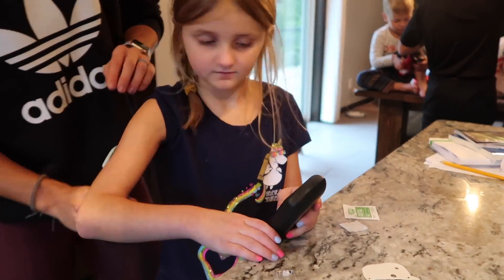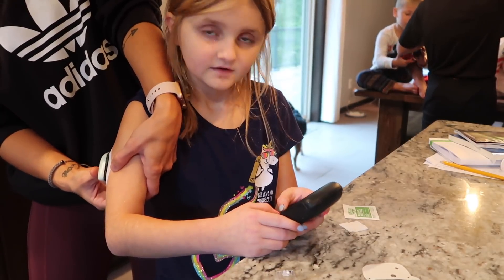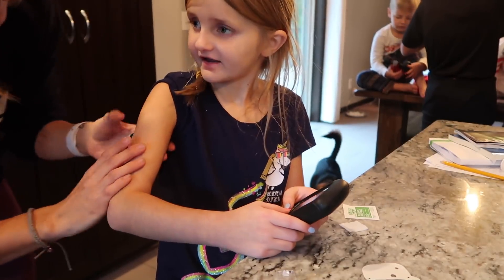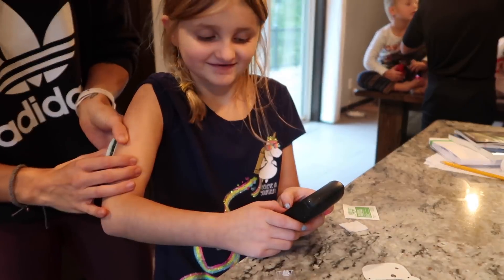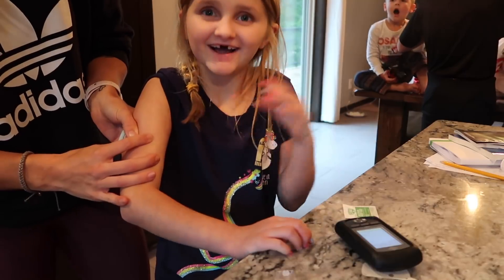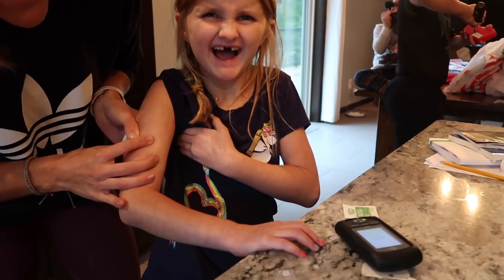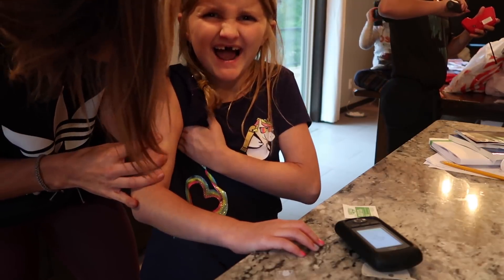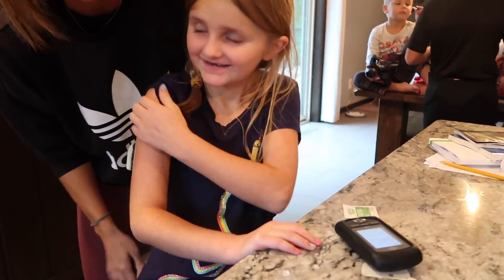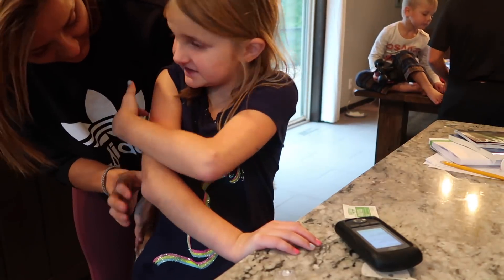Okay, next. Is everybody ready to be loud? Start. Ready? One. Good night and go balladay. Ow. Little poke? Yeah. I heard it. How's that? Ow. You okay? Yeah.